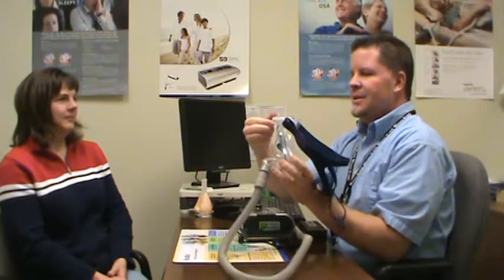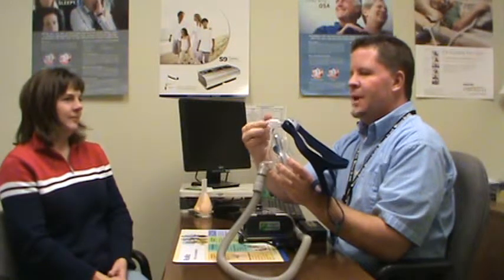Our next option is up top here. It's a dial, and it allows you to dial that forehead pad out. You can see as we dial, that forehead pad moves away from the mask. What this does is it angles the mask off the bridge of the nose and brings pressure down onto the chin. This prevents breakdown on the bridge of the nose, which is the most common problem with this type of mask. Now, the one thing you do want to watch out for is you don't want to dial it out too far, as you'll get leaks into your eyes. So it's a touchy adjustment, but one that you can adjust yourself.